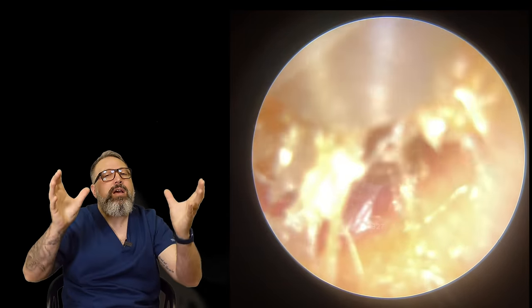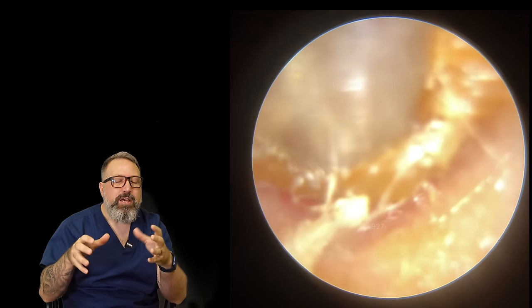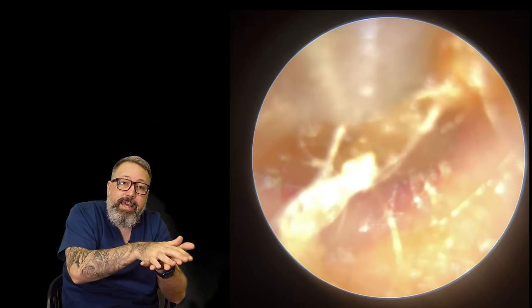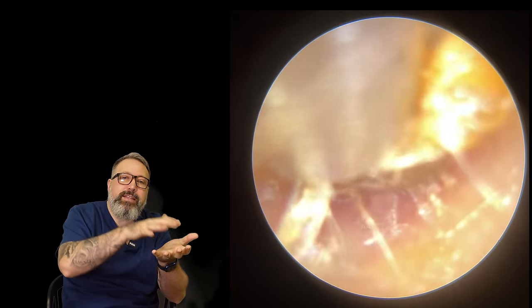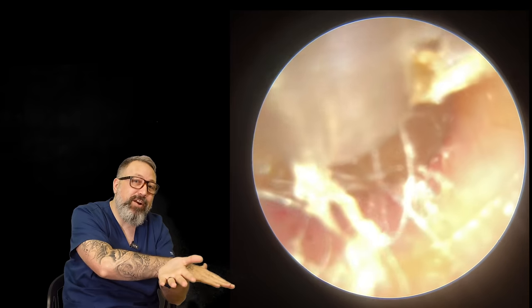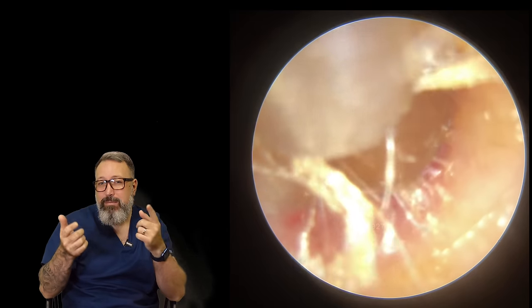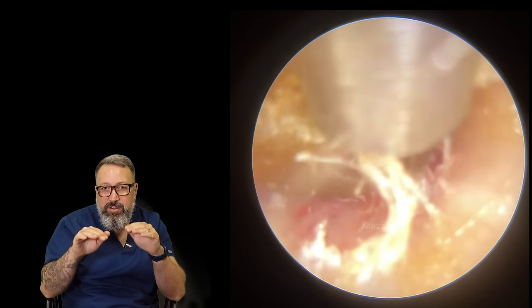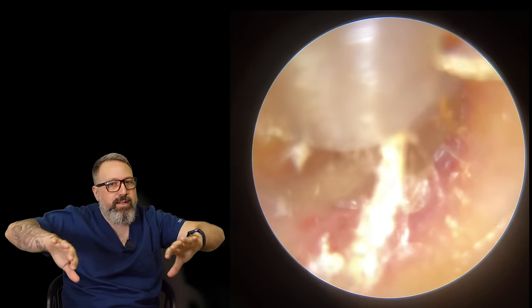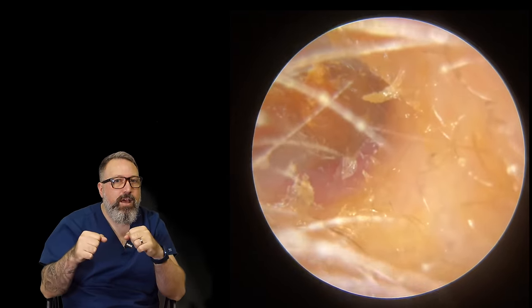What you tend to find with this type of plug is it's super duper sticky - really, really sticky, wants to adhere to the canal wall really well. You tend to find you get this sort of thin epithelial layer, this dead skin layer that comes away with it, and that's what's been anchoring it in place. So if you imagine the wax has been sticking to that epithelial layer, that surface skin layer, and then that has died off but it's still adhered to the canal wall. So you've got the wax sticking to the skin, the skin sticking to the fresher skin underneath - it's coming away, but very slowly. One thing you can do with these types of removals is pop a little bit of olive oil in there - it'll just work under the wax. And there's the oil going in now. Well done, Taylor Greene.